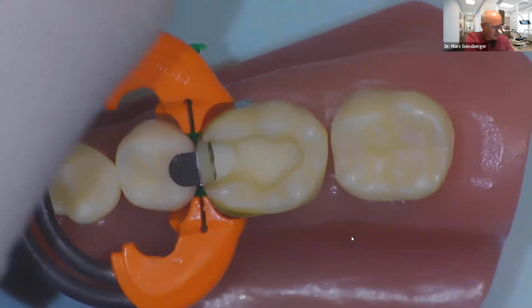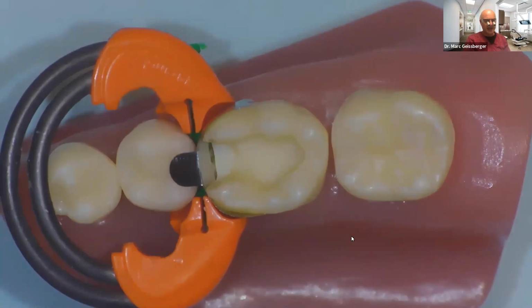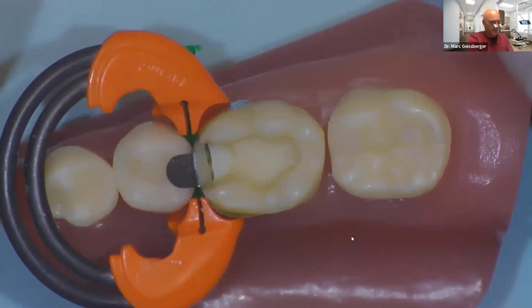Now, one thing with MPA Max or any filled adhesive is before dispensing, you want to get in the habit of shaking the bottle, even tapping it on the table, to allow the glass to get mixed evenly throughout the adhesive. It is very important, because what will happen is that glass can precipitate out of your bonding agent just by sitting. So I've got my bonding agent dispensed.